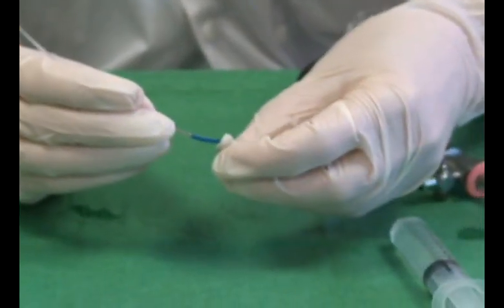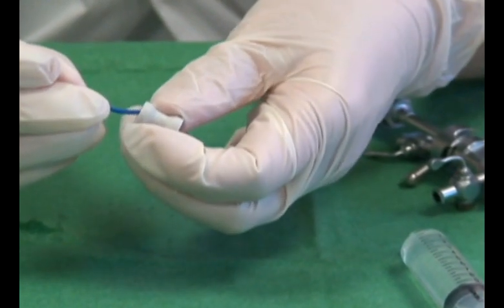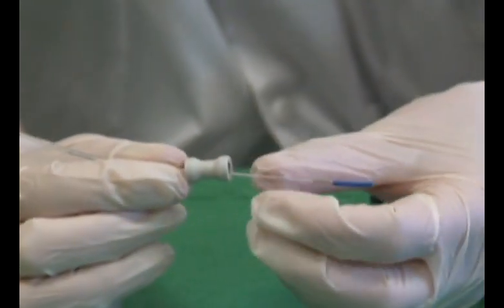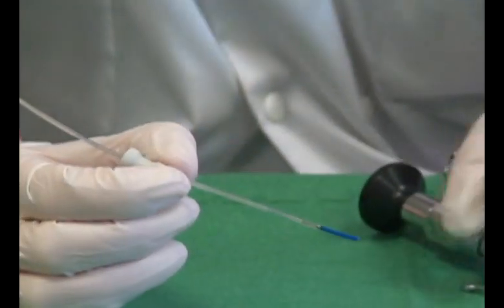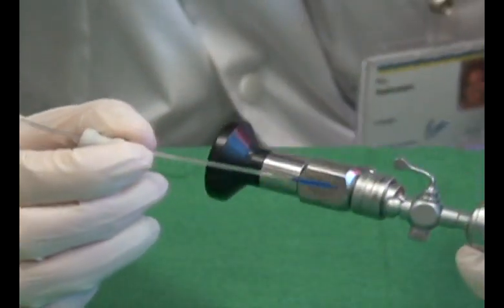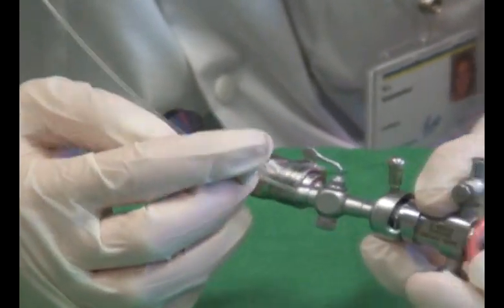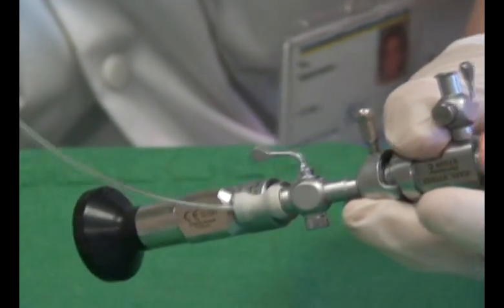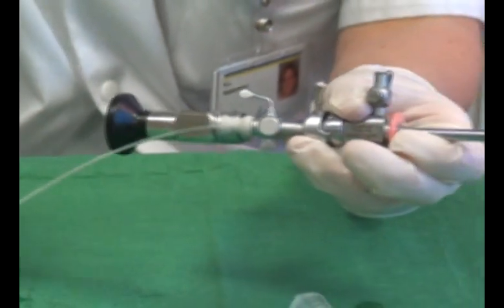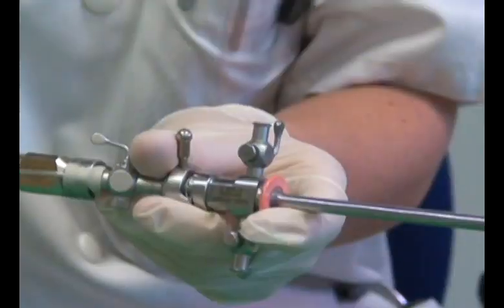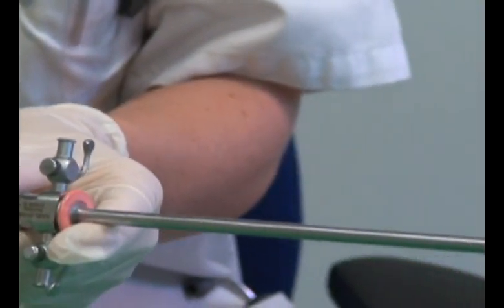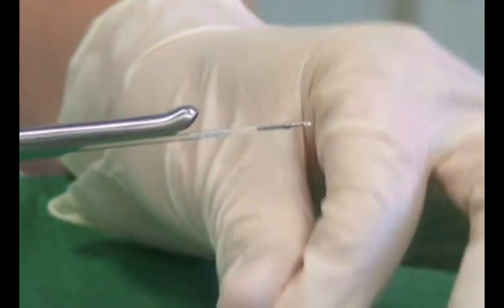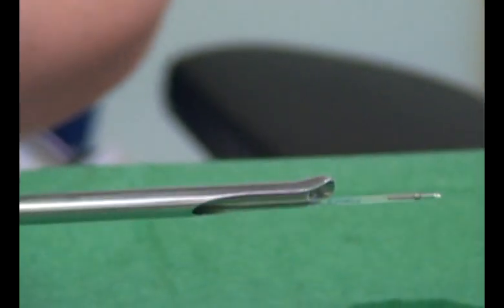The needle is passed first through the adapter, then through the working channel of the cystoscope. The adapter is then connected to the working channel to maintain water tightness. When the needle reaches the end of the scope, the cap is removed and the needle slightly retracted inside the sheath.